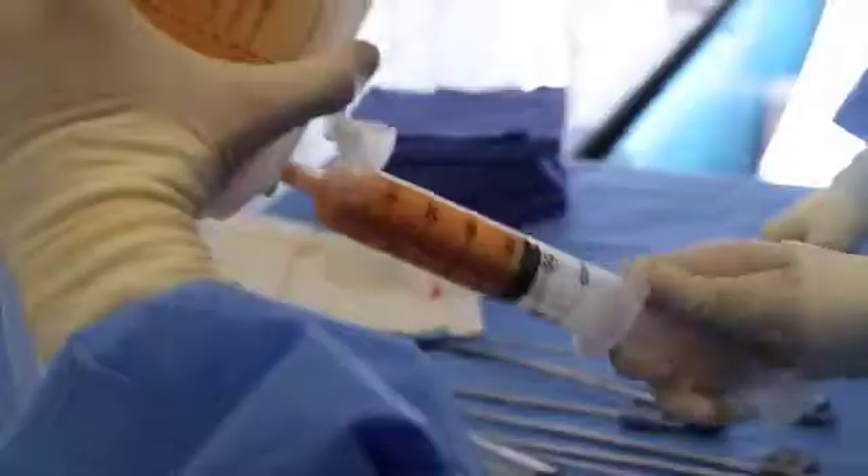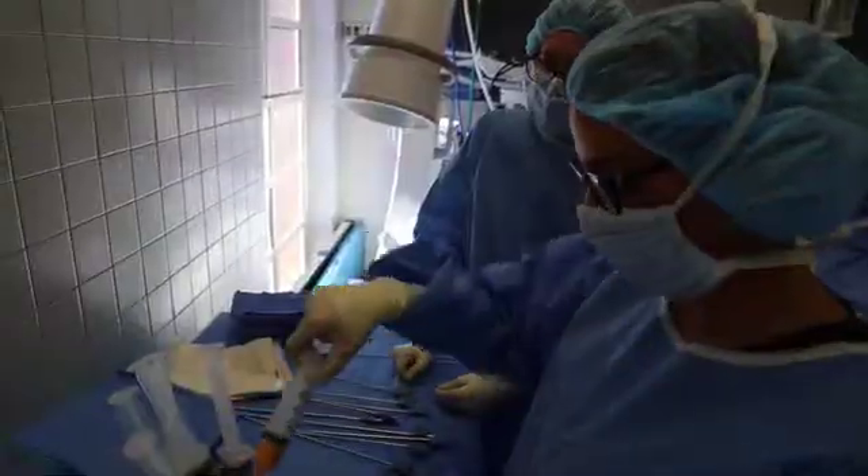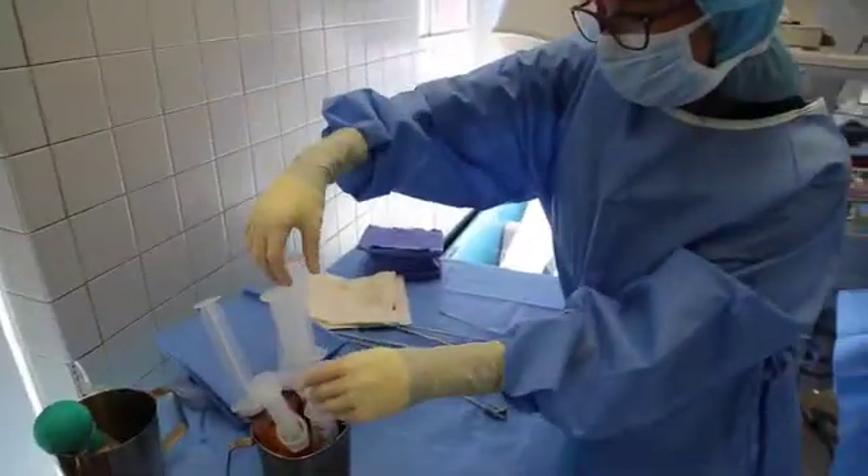Ooh, Illy. We have a lot. We're gutting it. All right. So this is going to settle out, so it's going to go to the bottom.